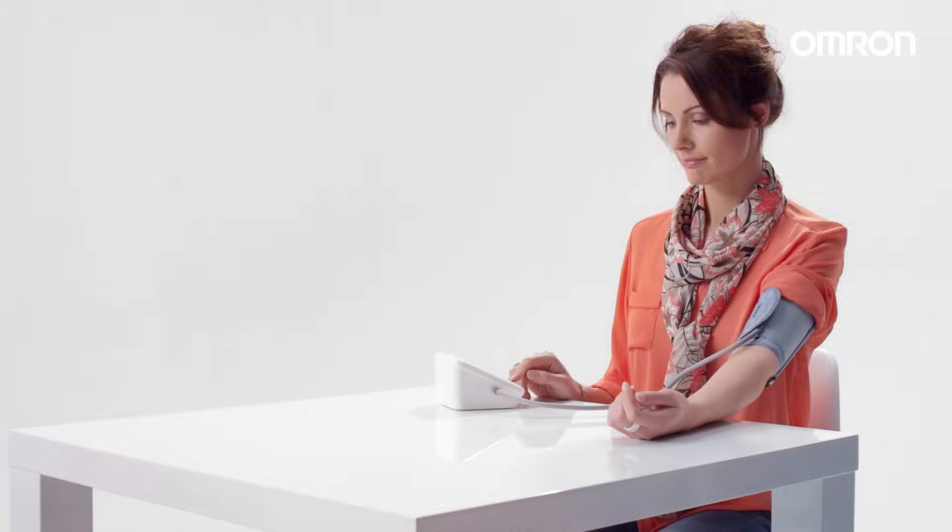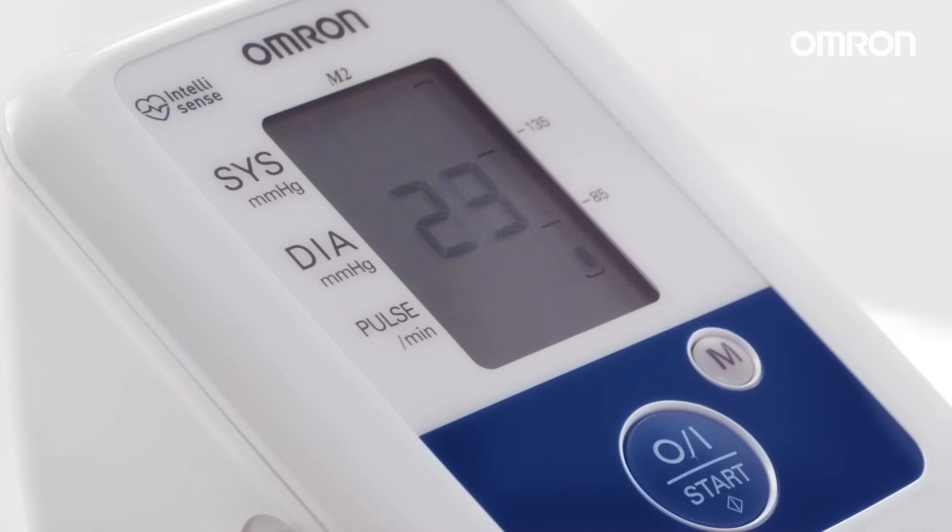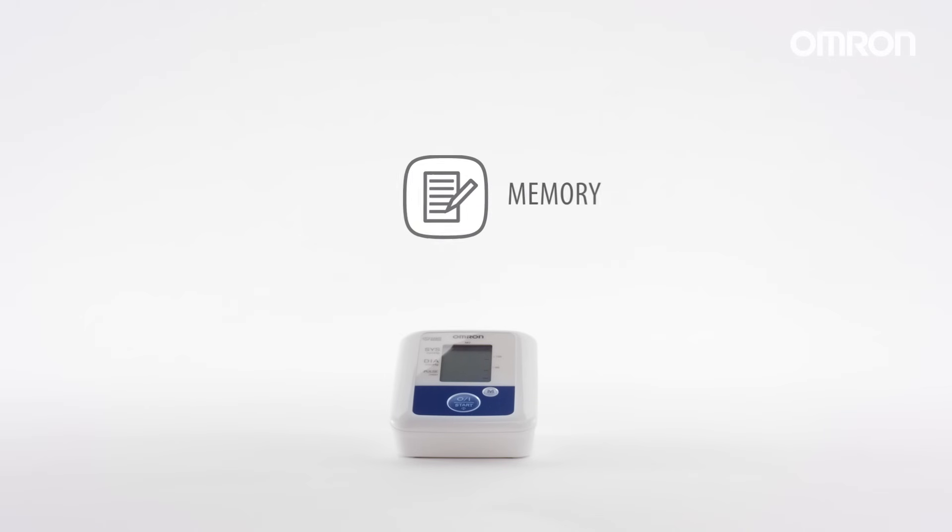Press the on-off button and the cuff will start to inflate automatically. The large display is easy to read. Measurements are saved automatically.